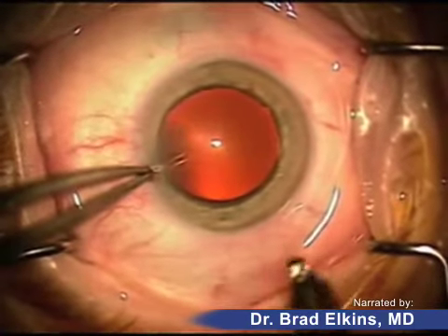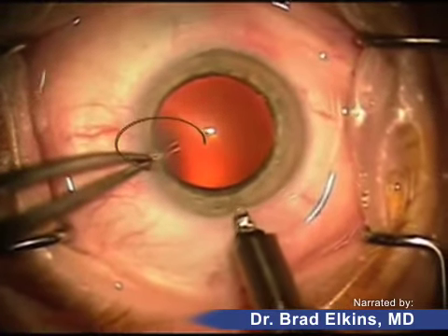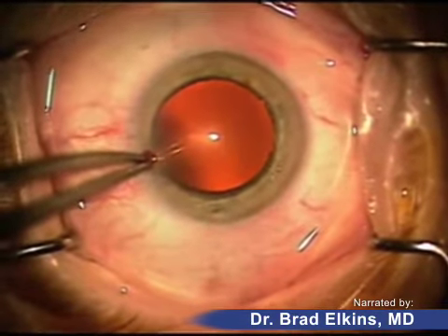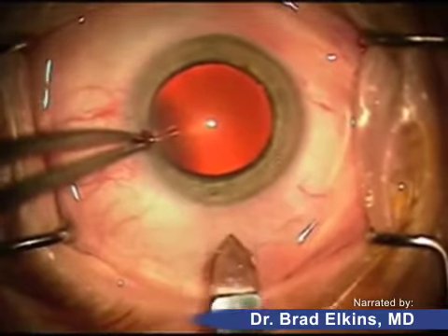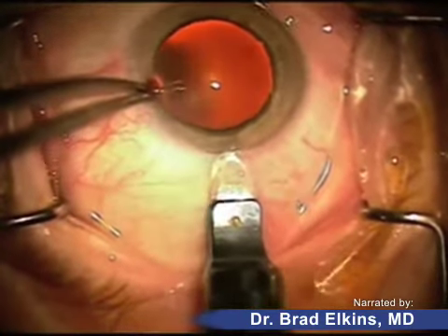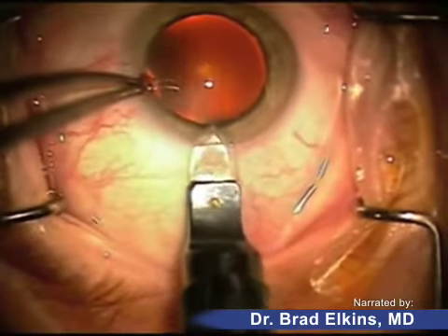Next you're going to see the incision being fashioned with two different types of diamond knives. The reason for the diamond knives is they make a very precise and clean incision. The goal here is to make this self-sealing, meaning that we don't need to put any stitches at the end of the surgery to keep the eye watertight.